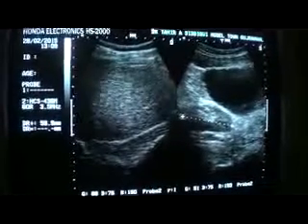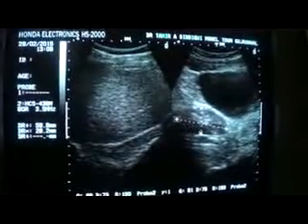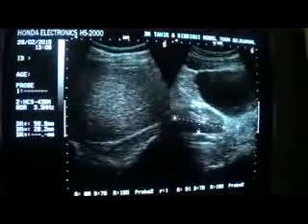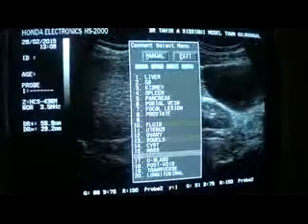This is the kidney, measuring 5.9 by 2.8. This is a low-lying ectopic kidney that is seen in the pelvic region and is not seen in the right lumbar region. This is the urinary bladder.